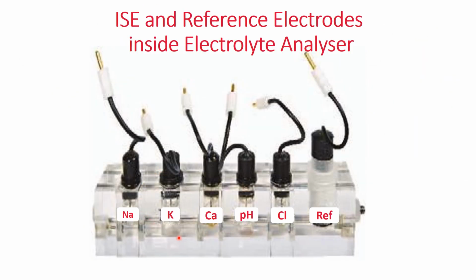So this is how in the equipment it appears. If you open the equipment, you will see the inner part, the electrodes are like this. So it's there for sodium, potassium, calcium, pH, chloride, and there is a reference electrode with which they will be compared, and that is how from one sample all this can be found out. All the concentrations can be found out by a single sample by comparing it to the reference electrode because it has a standard in it and the standard has known values of each of these ions.